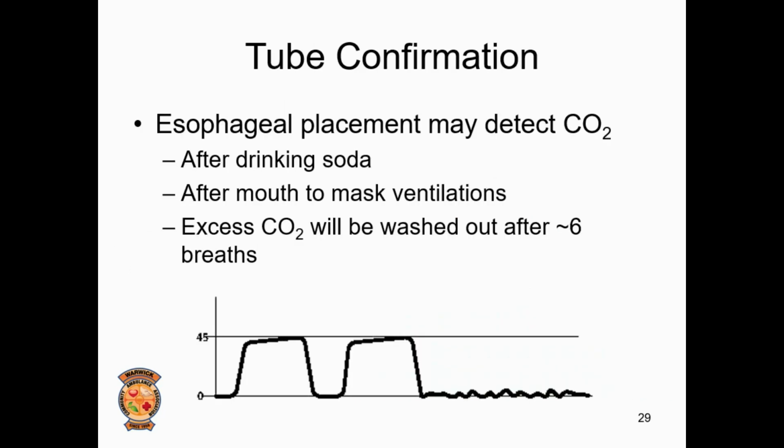There are a few caveats to tube confirmation in cardiac arrest. If the patient codes shortly after drinking a soda, or after you intubate them after having some mouth to mask ventilations, there could be some residual CO2 from either the soda or the person who was doing mouth to mask ventilations expiring some CO2 into the patient. The good thing is that CO2 will be washed out after approximately 6 breaths, and if you continue to have a nice squared waveform, then you're safe to say that you're in the trachea and not in the esophagus.